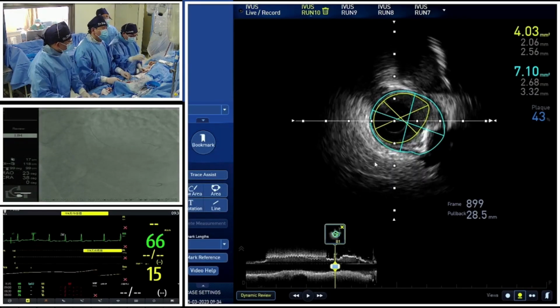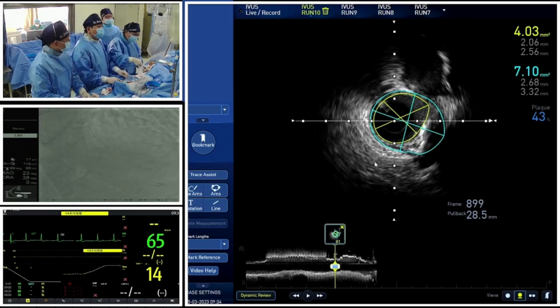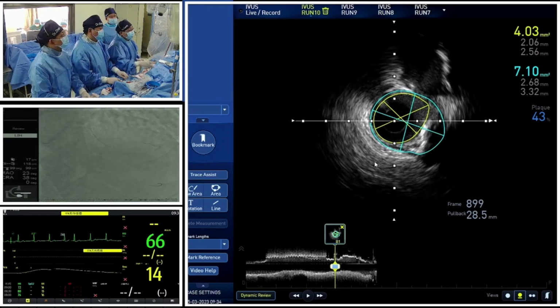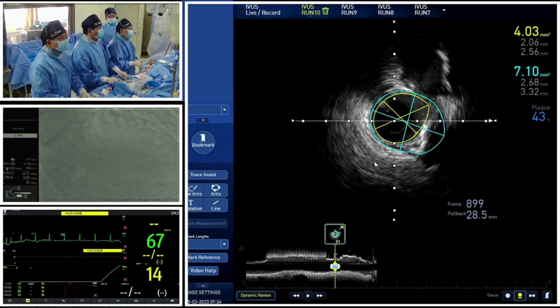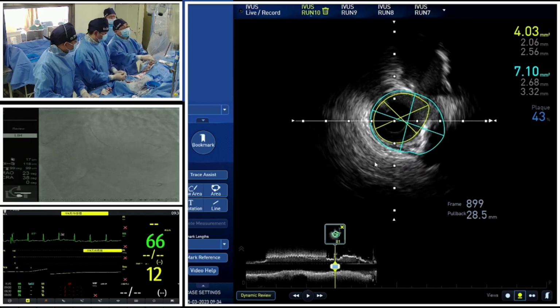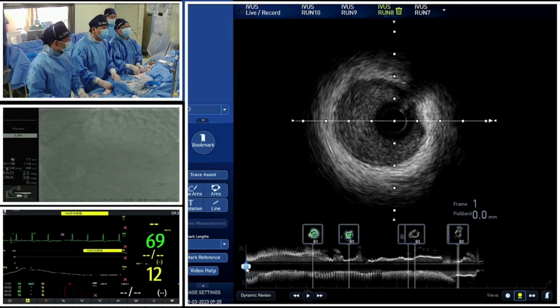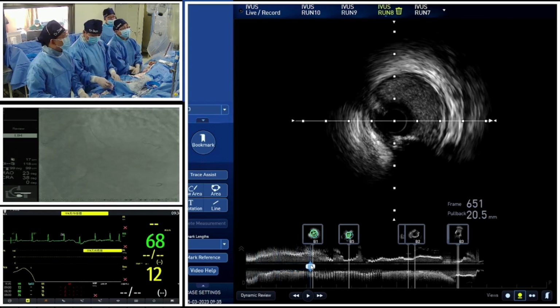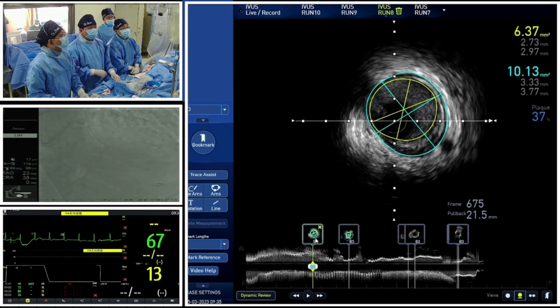Yeah. If after stenting the ostium of the first diagonal branch is occluded by the stent struts, we will perform kissing balloon inflation. Next, we will perform pre-dilation of the LAD lesion with IVL, right? So with the IVUS image, you can choose the IVL balloon based on the length and the arc of calcification, and also the lumen diameter.